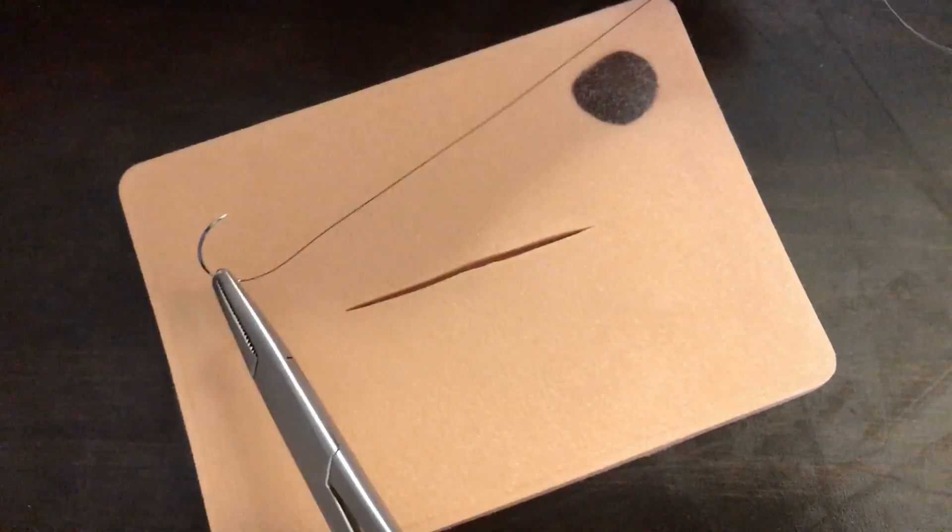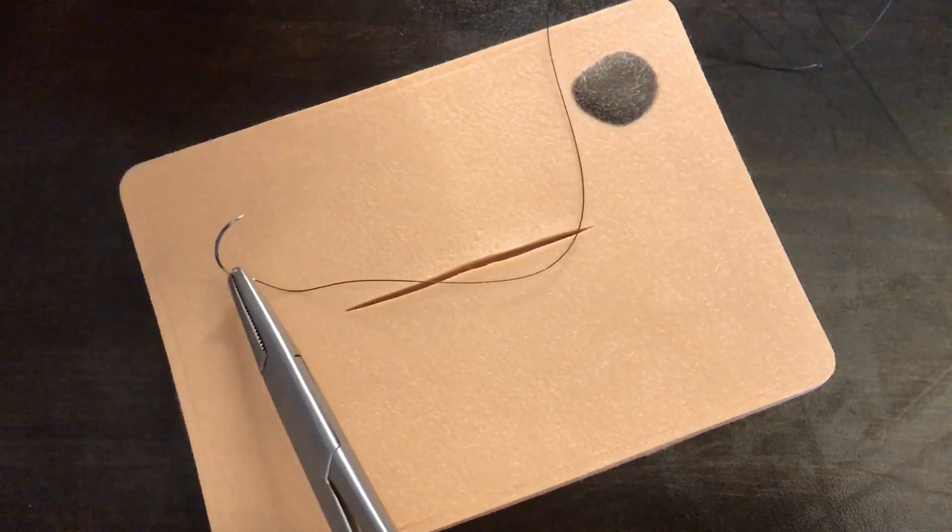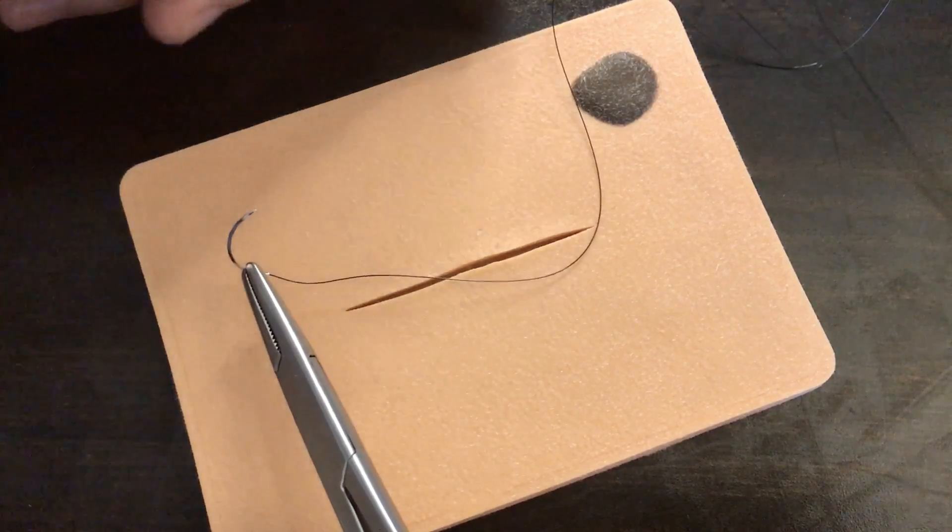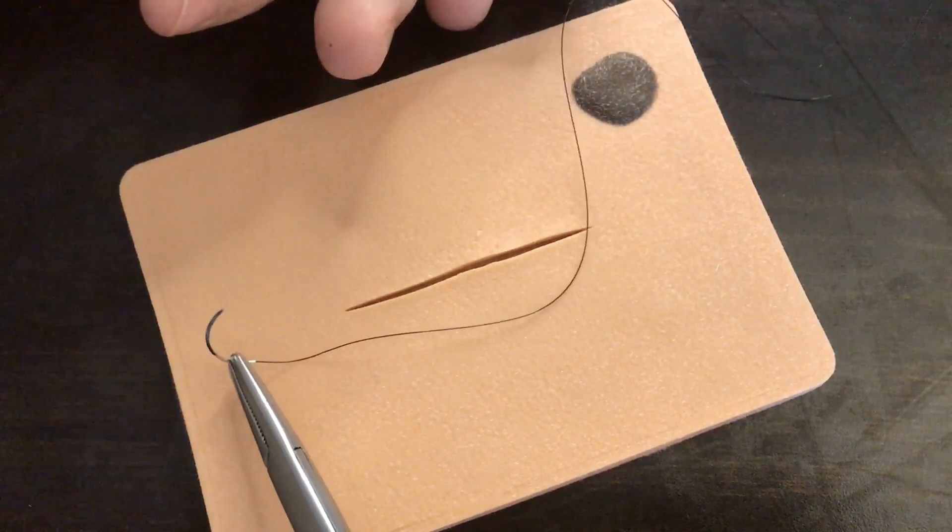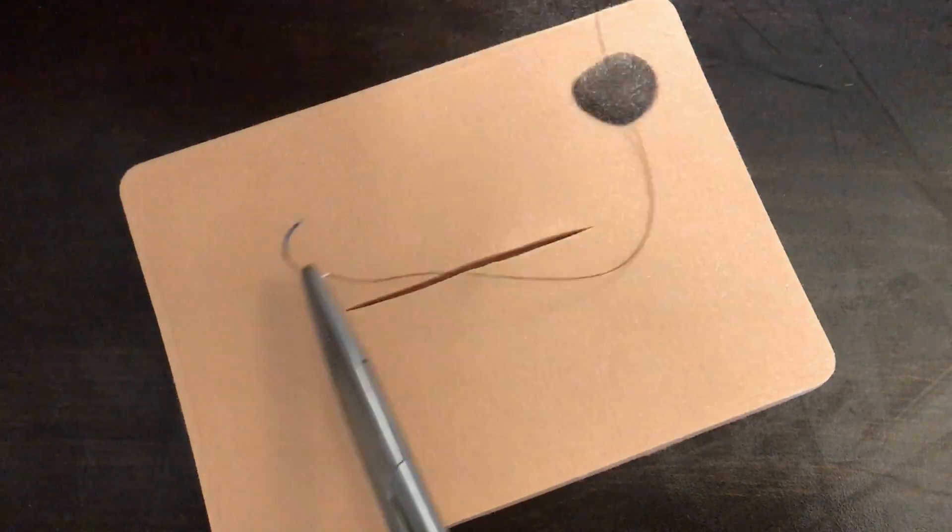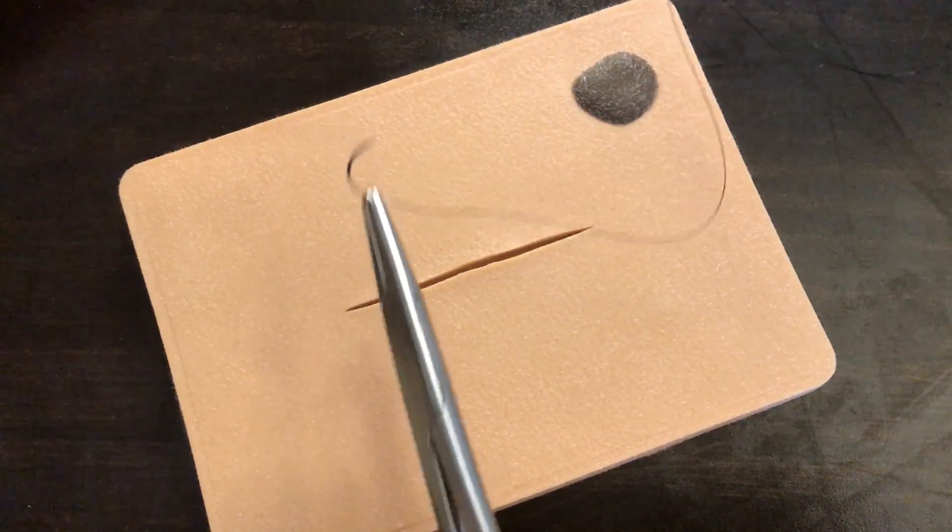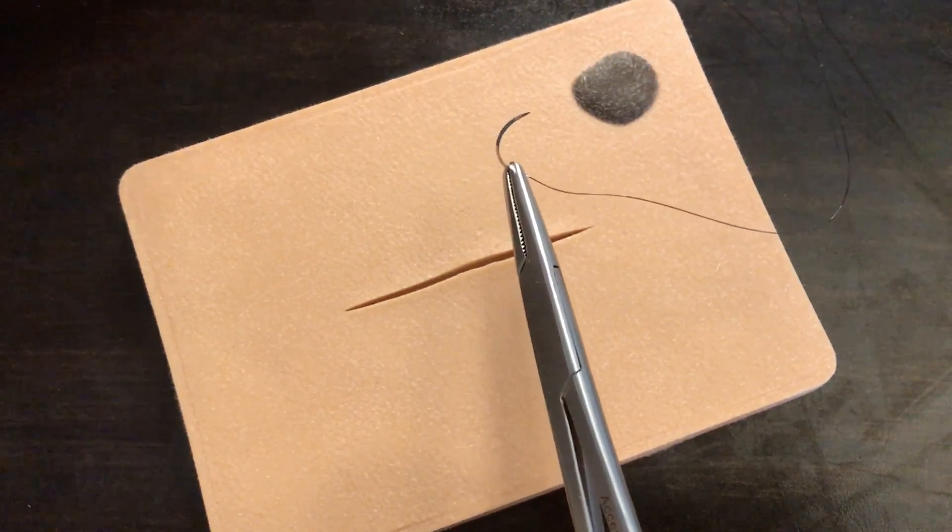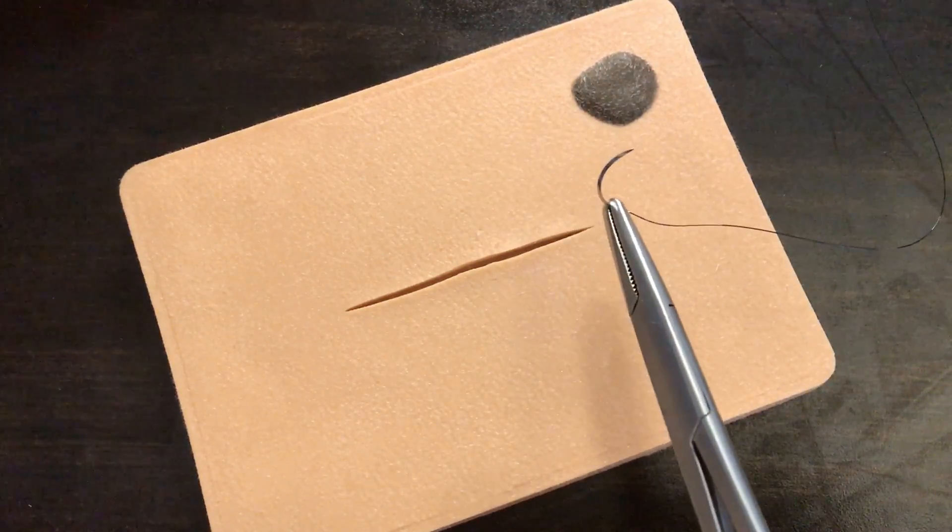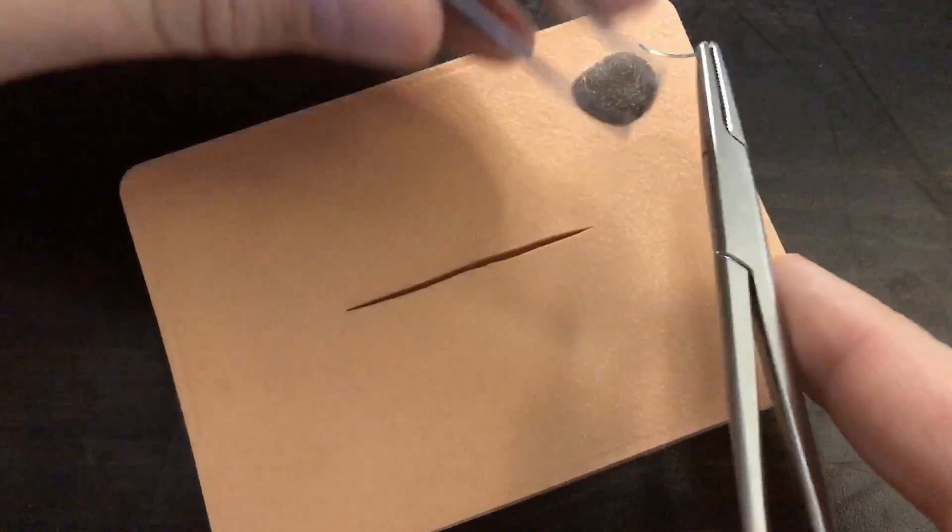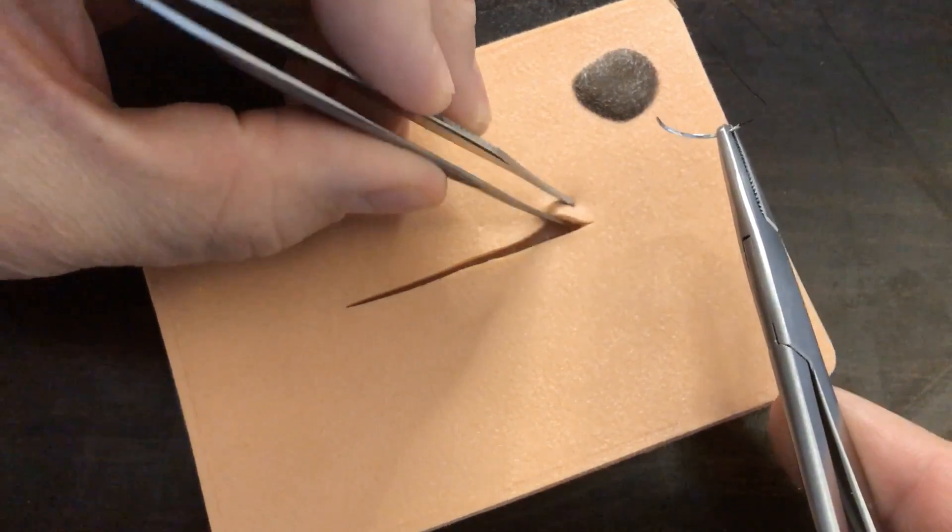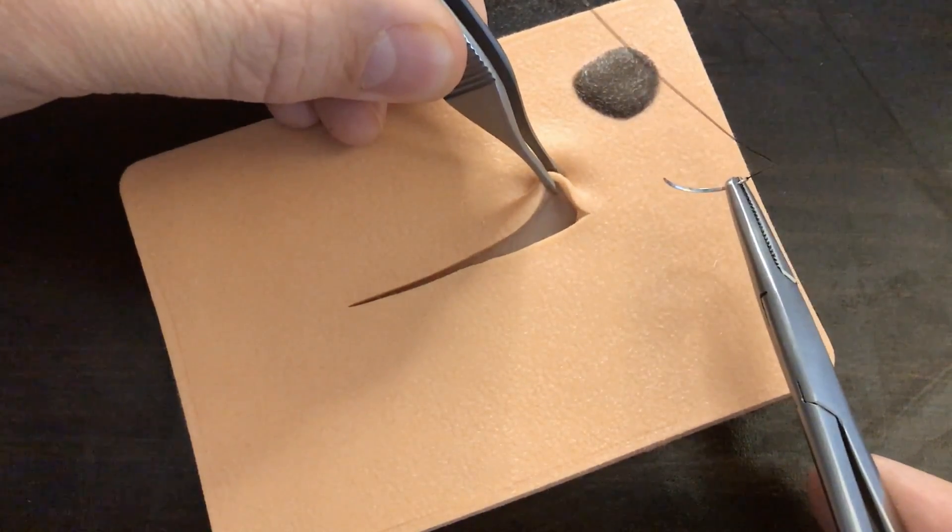Now the suture that you would use to do subcuticular would need to be something dissolvable. Generally I use something like a 5-O monocryl. Now 5-O monocryl does not look like this. This is a 4-O nylon. I'm simply using this 4-O nylon for the video purposes so that you can see what I'm doing. If I were actually using a 5-O monocryl which looks a lot like small fishing line, you might not actually be able to see it very well in the video. So understand that 5-O monocryl is a good suture material for a subcuticular stitch.